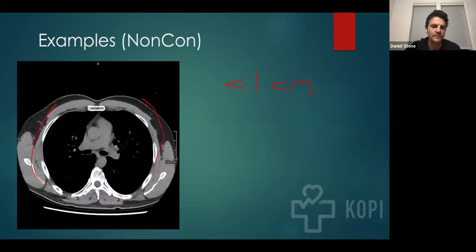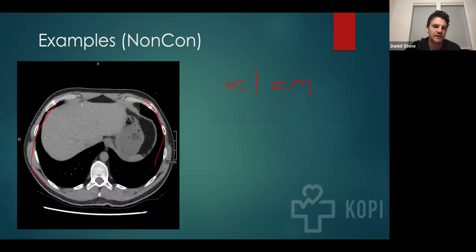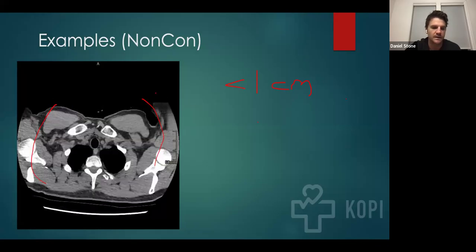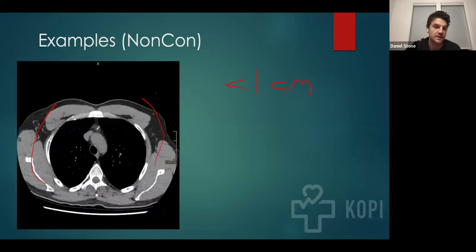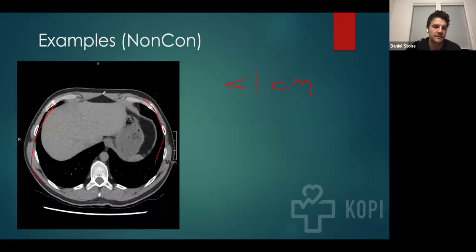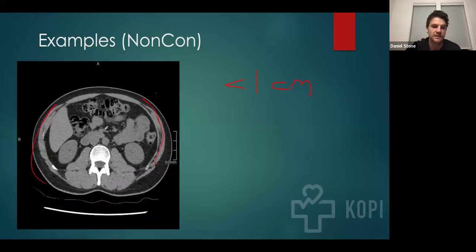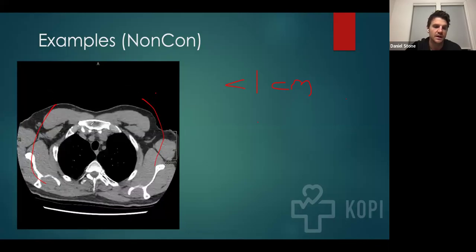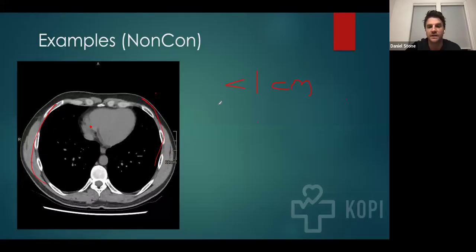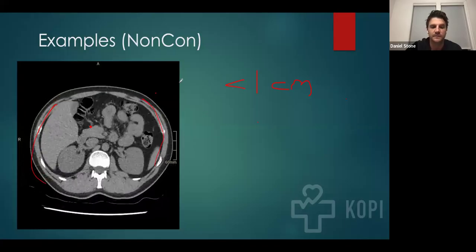When you don't have any contrast for a CT scan, lung nodules are very common, and a lung nodule won't necessarily enhance or take up any IV contrast if you do the CT chest with contrast, but a lung nodule will basically look like a very small dot that you'll only be able to see in a very small plane. And it'll come and go and it will look different than a blood vessel.